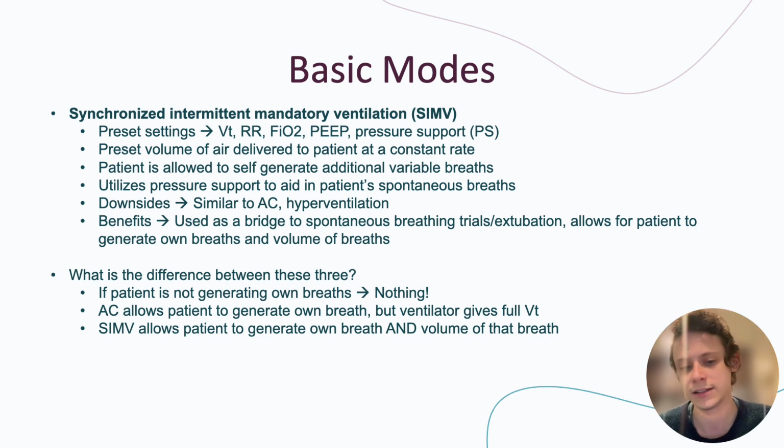Some downsides, just the same as assist control, you have the hyperventilation risk. Benefits, it is used as a bridge to spontaneous breathing trials and extubation because it allows for the patient to generate their own breaths and own volume of breaths.